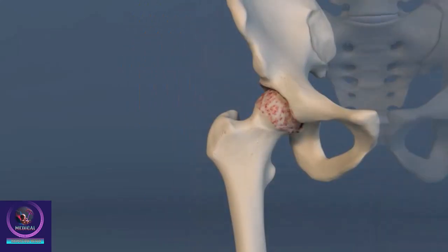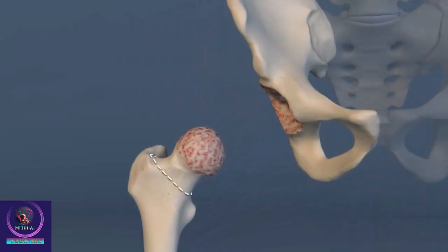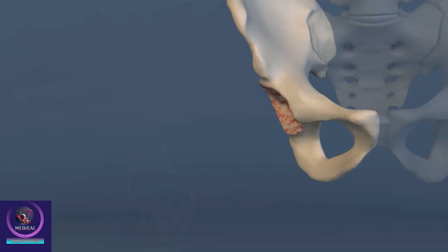The surgeon creates an incision to expose your hip joint. The damaged head of your femur is removed. The surgeon carefully removes damaged cartilage and bone from your hip socket.